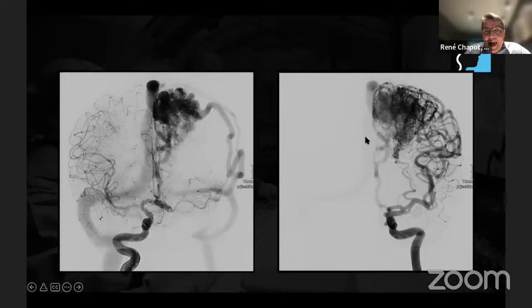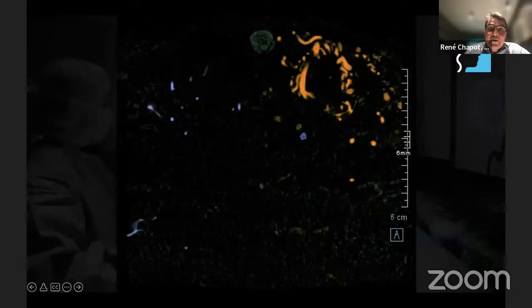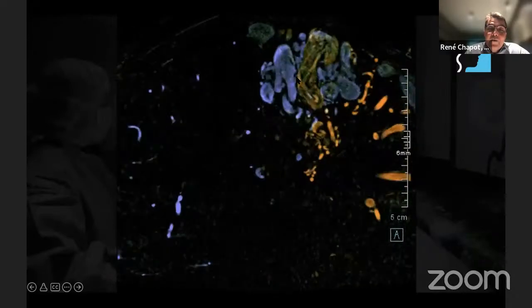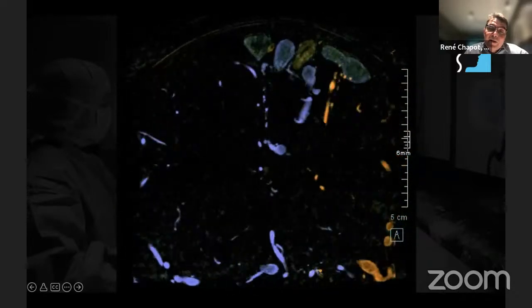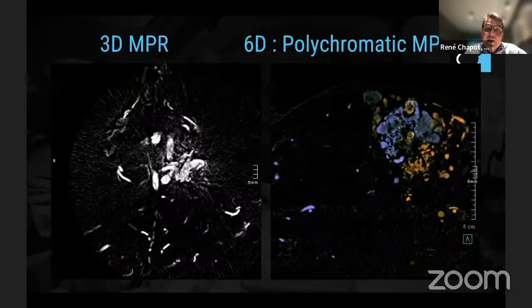Also because angio is the most precise way to understand, but angio is very frustrating because we just see one artery and we don't see all arteries together. So if we mix here those pictures, we can really precisely look at how the veins come together and then we can define which vein we want to access primarily, which arteries we need to control. And this way we can treat and cure those kind of pictures.